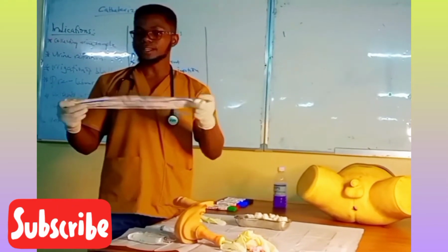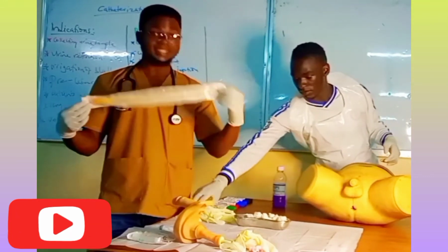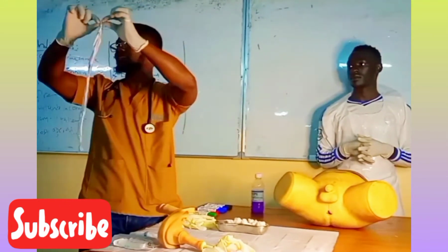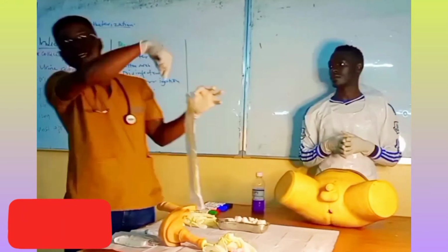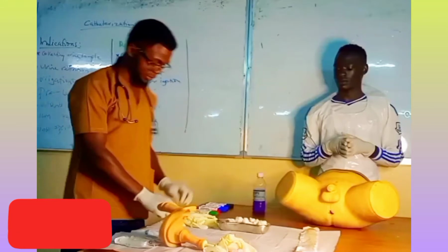So there is this first seal. My assistant is going to hold the seal like this, then open it. Since I'm going to be in sterile surgical gloves, I will pick the sterile part which is inside. Are we together? Let's see how we do it.